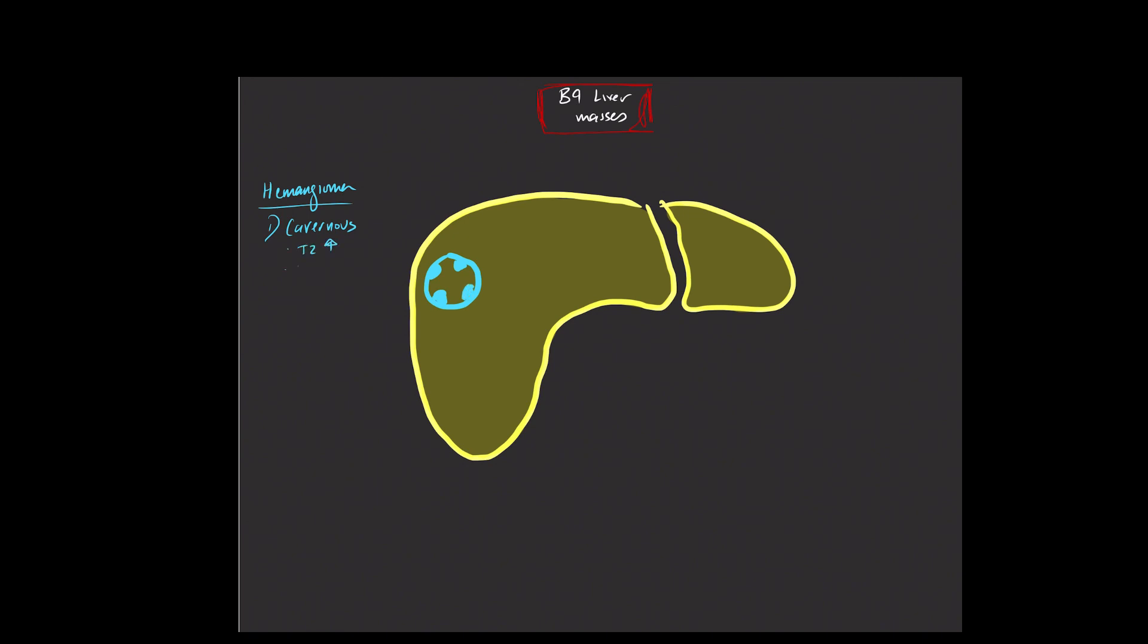When you give contrast, there's going to be this peripheral discontinuous nodular enhancement. It's going to look like little puddles of enhancement along the periphery of the lesion. And when you image on the different phases, that nodular enhancing component will fill in in a centripetal fashion.